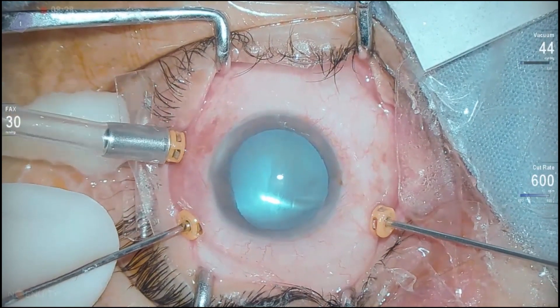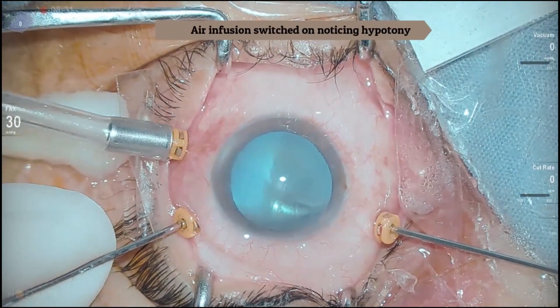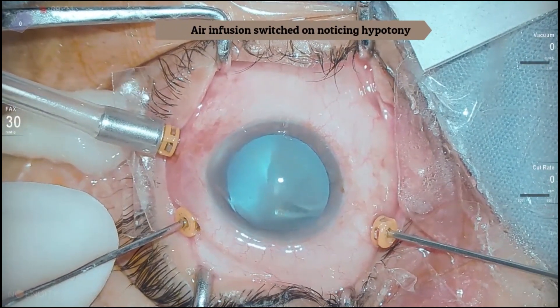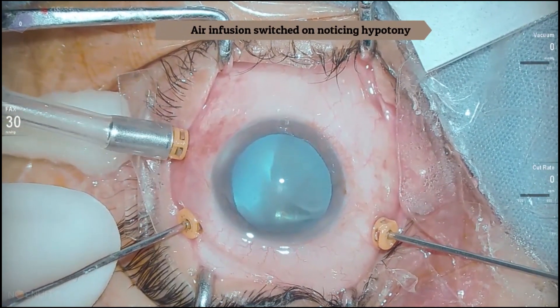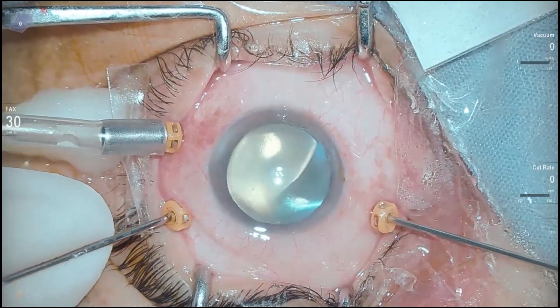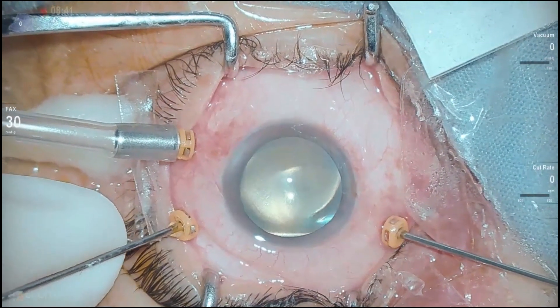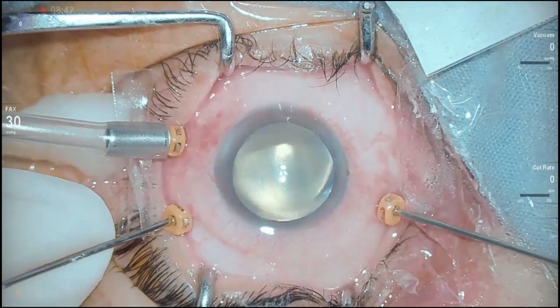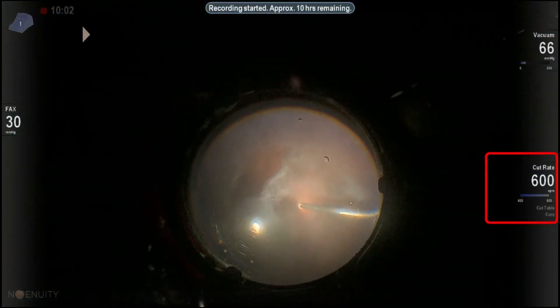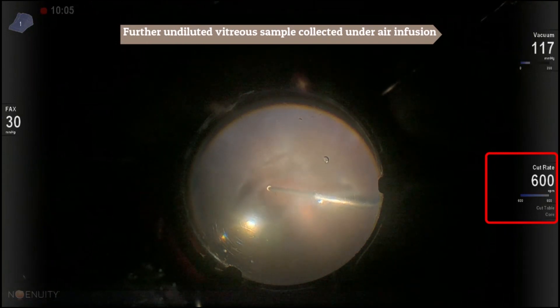As the globe started to collapse, air infusion was switched on to prevent hypotony. Further undiluted vitreous sample was then collected under air.